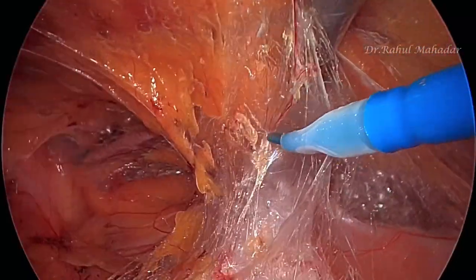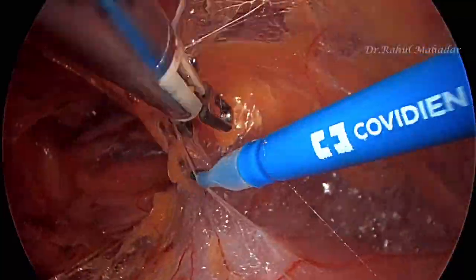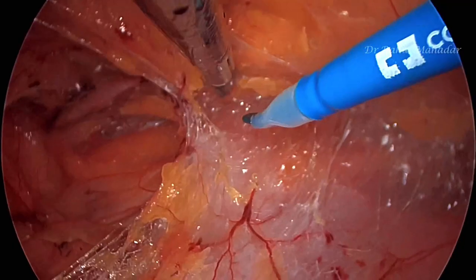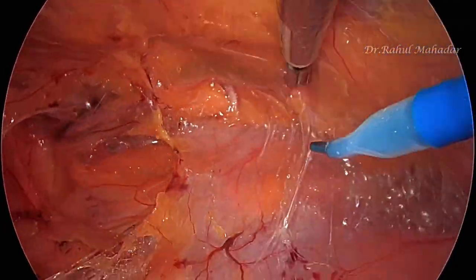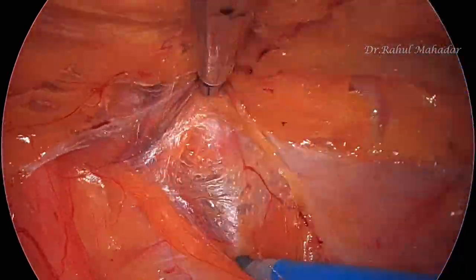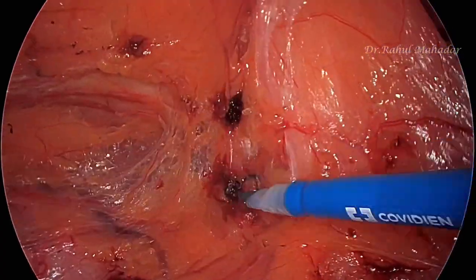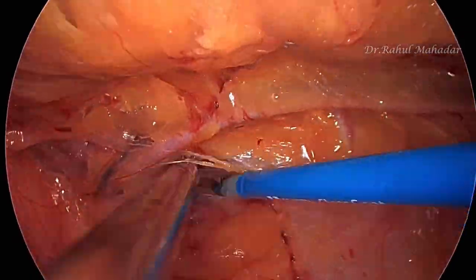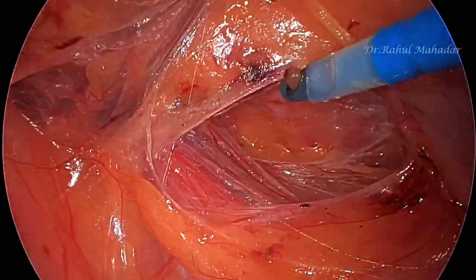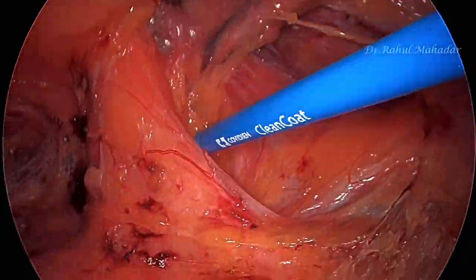We are now doing the space of Retzius dissection. This special spatula instrument has a handheld cautery tip, which makes it quite easy to handle — like open surgery. It improves ergonomics as well as the precision of the surgery. With the cautery on the fingertips, it becomes quite easy to keep the operative field very clean.